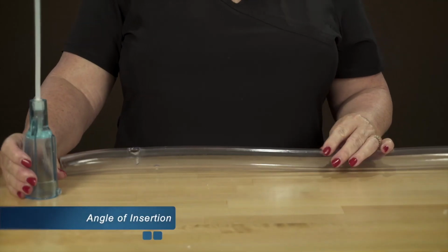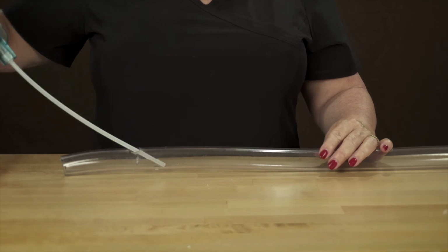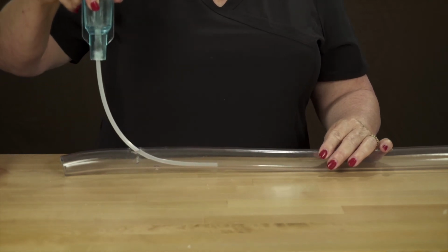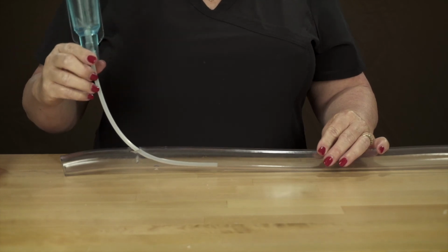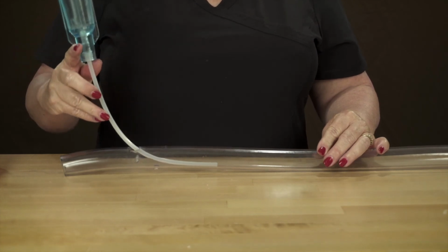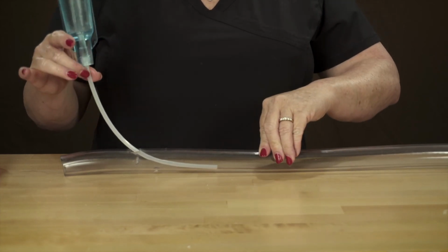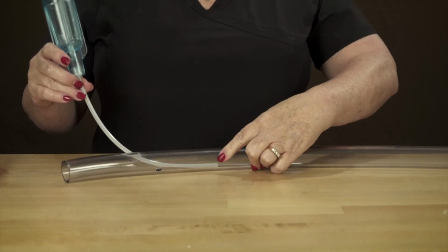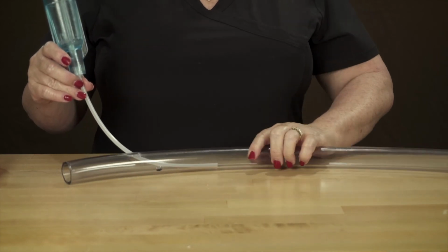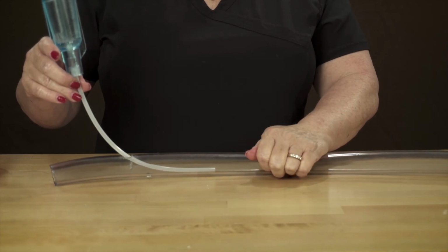Angle of insertion. Insert a catheter with a high angle of insertion to demonstrate the difficulty of turning the corner with the cannula, the challenges in securing this device, as well as limiting vein purchase, as too much length has been used traveling through overlying tissues. Point to the area where the cannula will be in contact with the vein wall, creating friction, which can lead to mechanical phlebitis and failure of the peripheral IV.